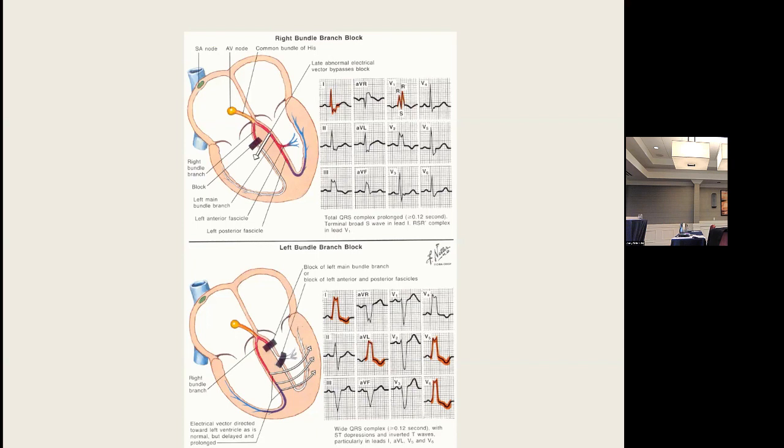And if you depolarize abnormally, instead of using conduction tissue and the wiring, I cut the wire so that I hit the switch and all the lights don't go on. The lights eventually go on because of cell-to-cell transit. If I do that, I repolarize abnormally. And here's where you get the deep S waves that everyone was looking at and saying, oh, that's ischemia.